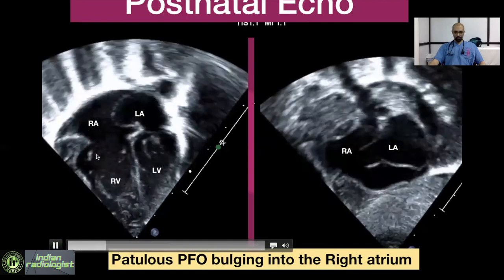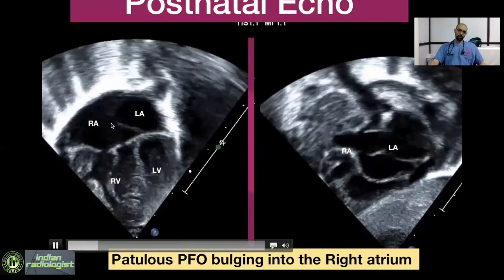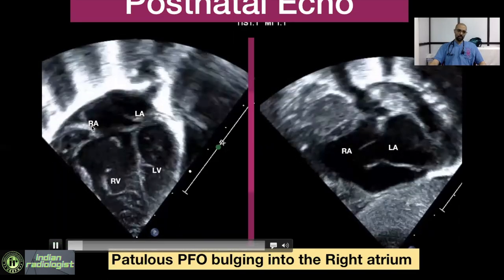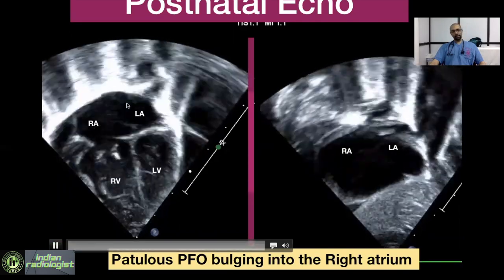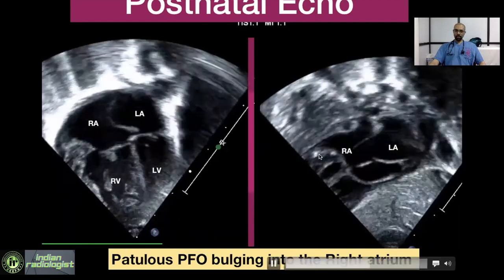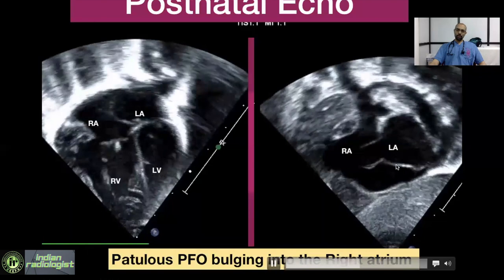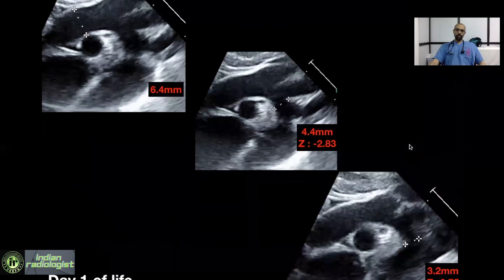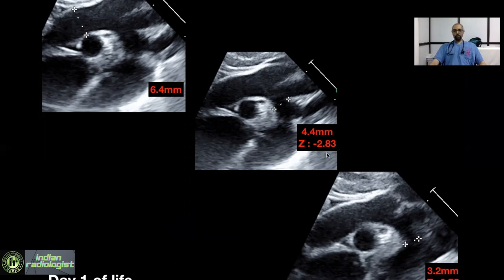On postnatal echo, in the apical four-chamber view, the septum is still patulous but is now moving toward the RA, whereas in the fetal echo the aneurysmal septum was encroaching into the mitral inflow. The subcostal short-axis view again shows the same patulous foramen ovale bulging into the right atrium. The arch dimensions show ascending aorta of 6.4 mm, transverse arch with a Z-score of minus 2.83, and an isthmus with a Z-score of minus 2.75, which are smallish on day 1 of life.